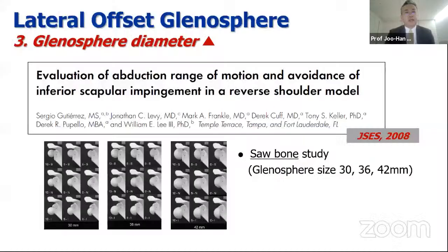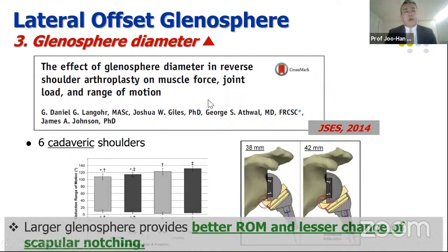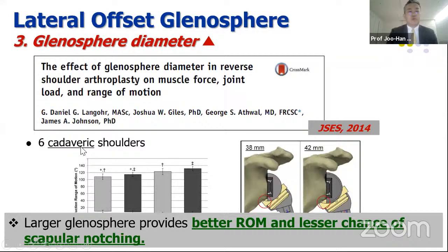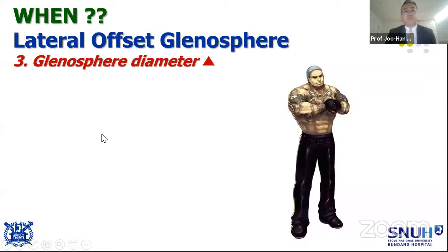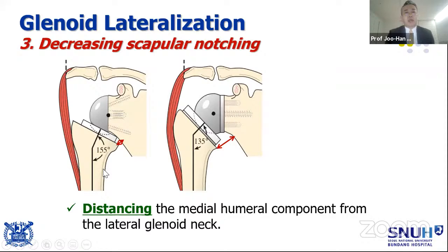The last way of lateralizing the glenosphere is thickness or diameter of the glenosphere. With a bigger glenosphere, 42 or 46, several biomechanical studies say there is better range of motion and lesser chance of scapular notching. So we can use a bigger glenosphere if the patient is big enough. With this glenoid lateralization, we can improve the contour of the shoulder and get more stability. And also we can decrease scapular notching and improve external rotation of the patient.